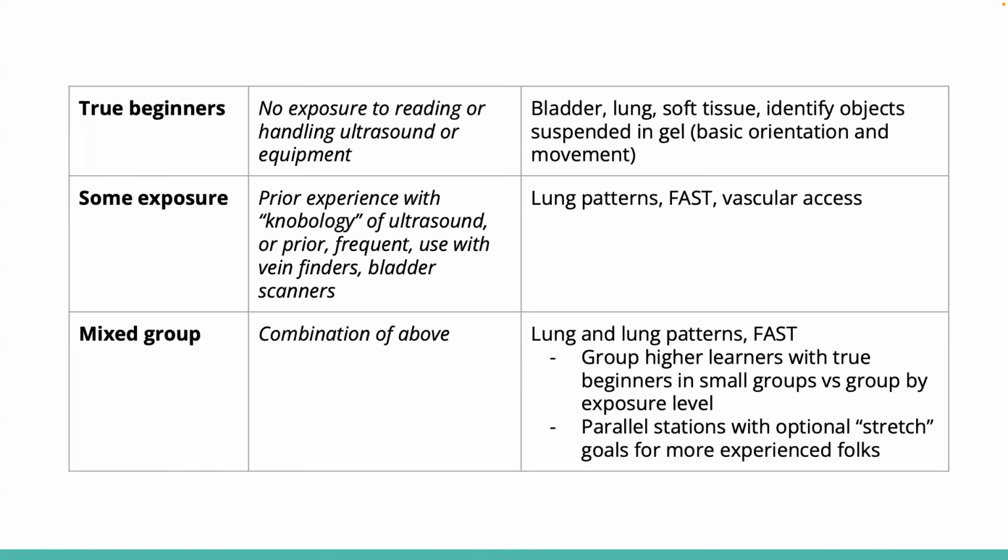And then with some exposure, like I talked about, using different lung patterns, so doing normal lung plus abnormal lung, or setting up your workshop within the scaffold of a FAST or a RUSH exam, or vascular access, in addition to what you can do for the true beginners.